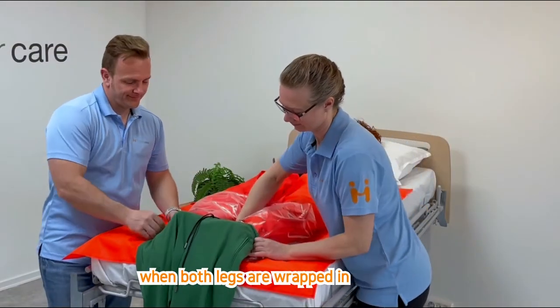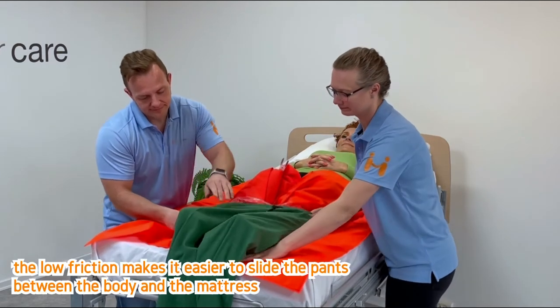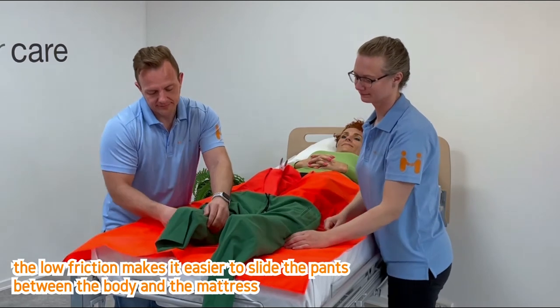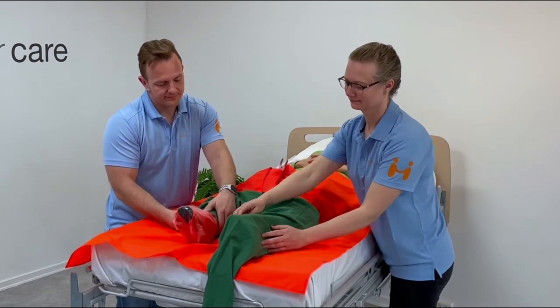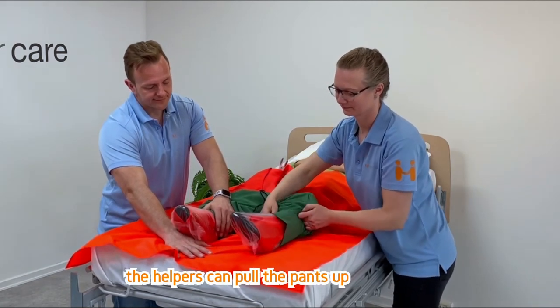When both legs are wrapped in, the pants can be slid on. The low friction makes it easy to slide the pants between the body and the mattress. When the feet are through, the helpers can pull the pants up.